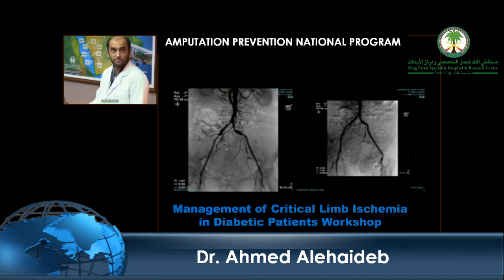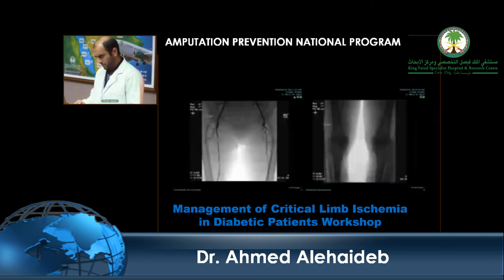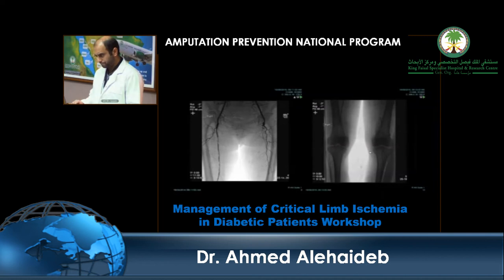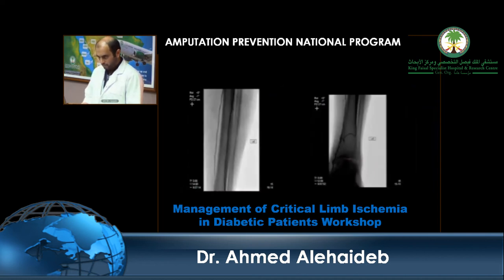However, it is patent. Further down, we have a total occlusion of the left superficial femoral artery, while the right is patent with multiple stenotic segments. Further below, we have bilateral patent popliteal arteries. Posterior tibial and peroneal arteries are widely patent. The anterior tibial proximally is not visualized.